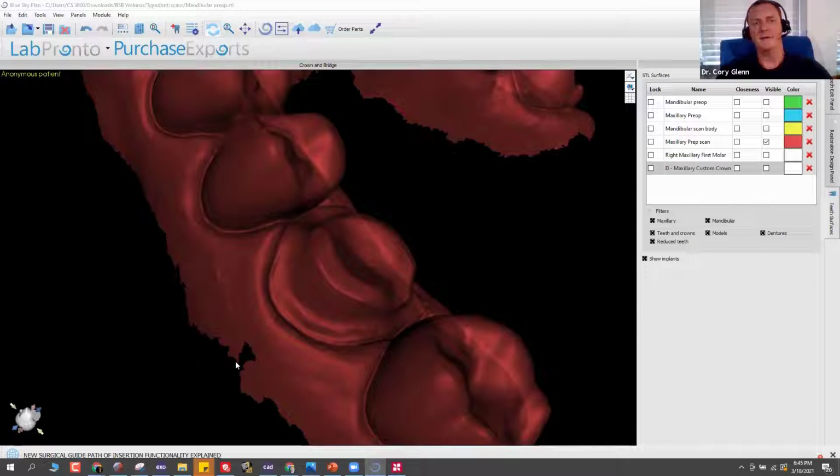If you feel like you need that higher resolution, you can do that. And then the EnvisionTech printers that I mentioned earlier, they're an excellent option as well. What I love about EnvisionTech is some of the innovative resins that they have. They do have a permanent crown and bridge resin. They've also got a denture-based resin that competes with the strength of a conventional acrylic processed denture, which is huge. I don't know of anyone else that has something in denture bases right now that would compete there.